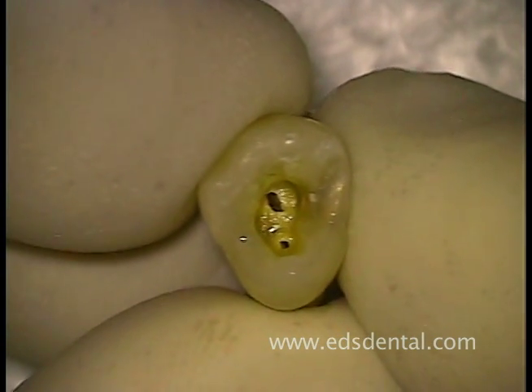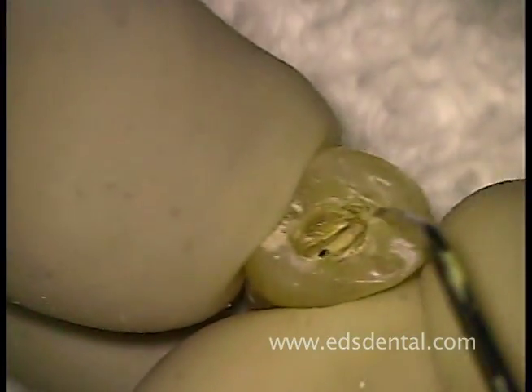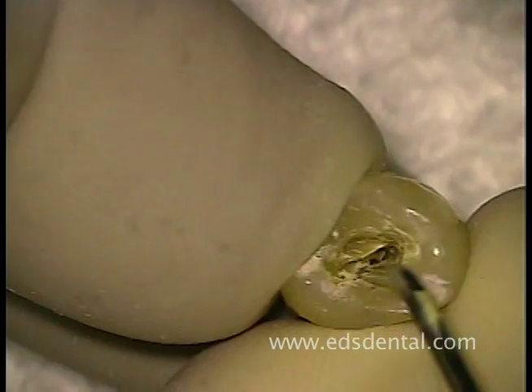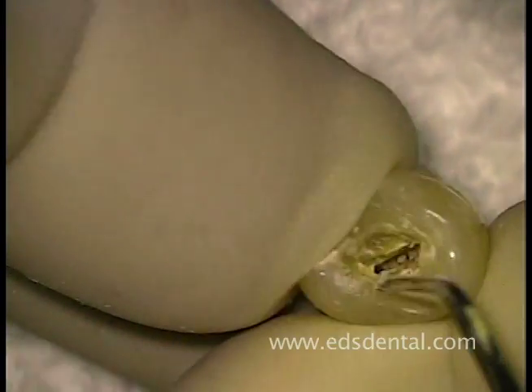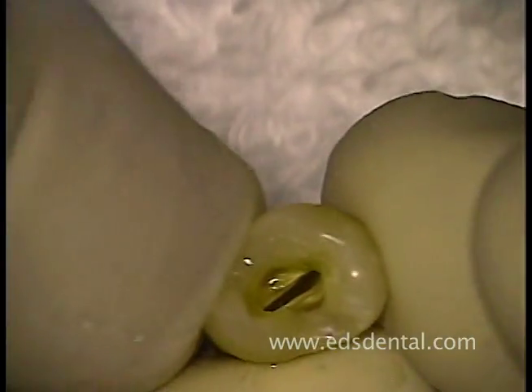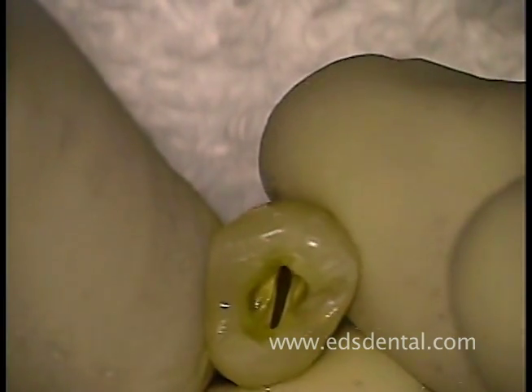Here you see an extracted bicuspid with two openings through the roof of a partially open pulpal access. After opening the access further, you see the oval shape of the canal with the buccal-lingual width as the major diameter. After irrigation with sodium hypochlorite, you can clearly see the oval borders of the pulp chamber.